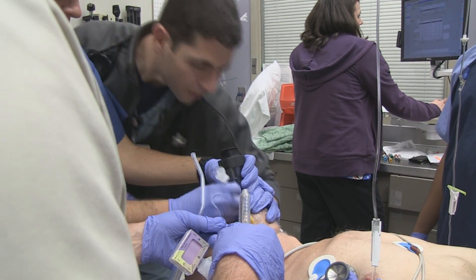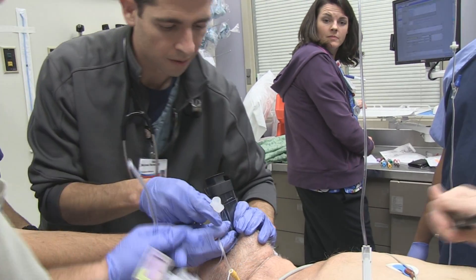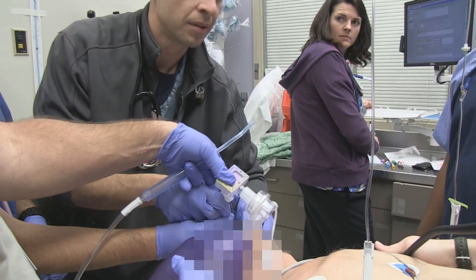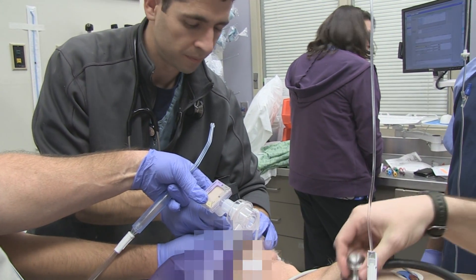That's the end. That's exactly where I had it last time. I felt you last time — going perfect, I thought too. There we go. We got color change that time.